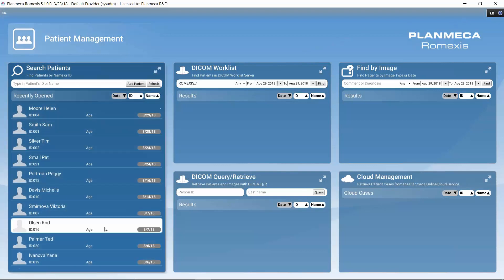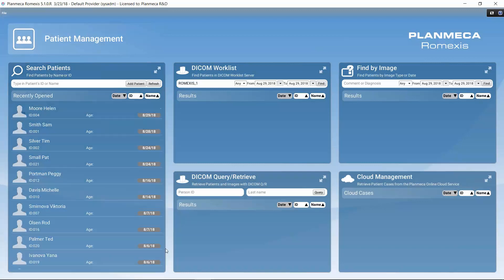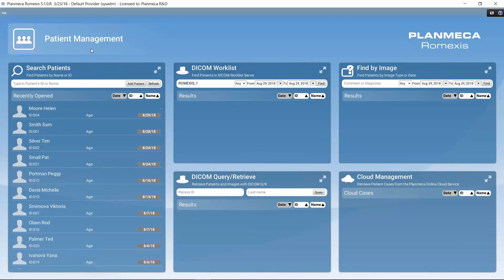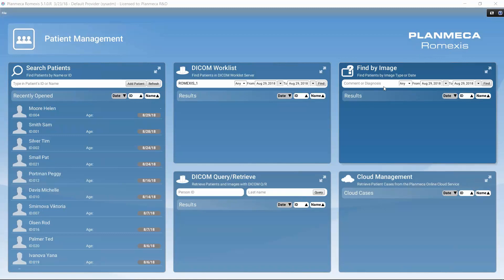When Romexis is opened directly rather than through practice management software, we see the integrated patient management, the DICOM worklist and DICOM query for those using them, and an image search feature. The image search lets us find images by comment or diagnosis within a specific time range without needing to remember which patient it belongs to. The cloud management section is for PlanMega Romexis cloud image transfer service users, where we can see sent and received cases and send new cloud cases.